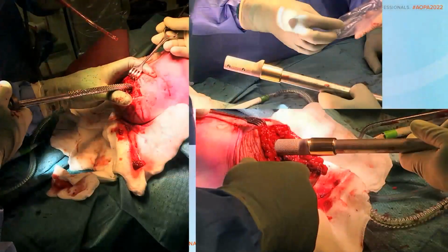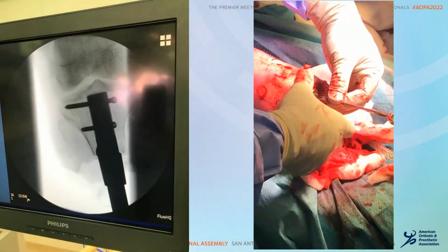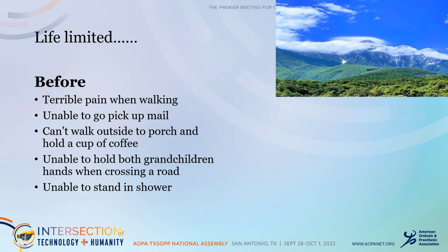We prepare the canal and then implant the device, then bring the implant through the skin at the same time, creating the stoma during that single stage technique. We still wait 6 weeks before allowing them to load, okay?